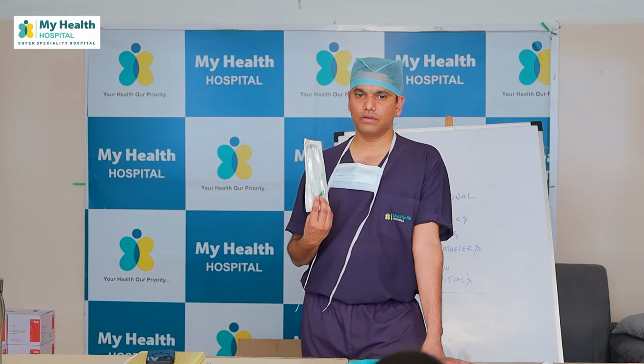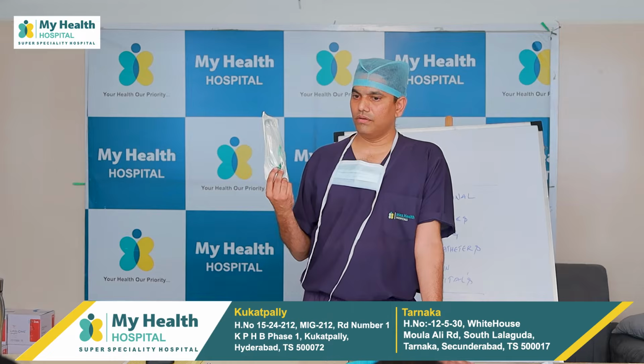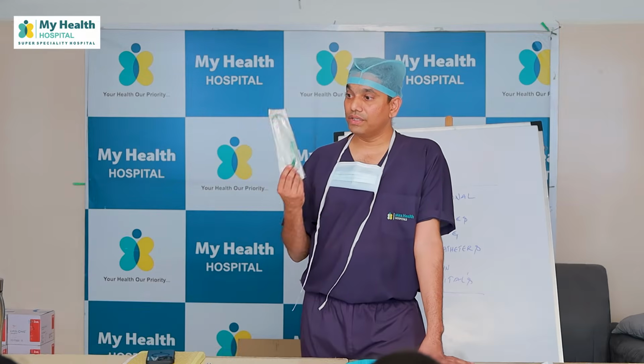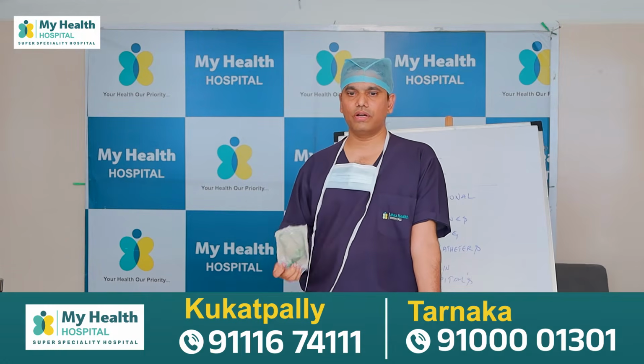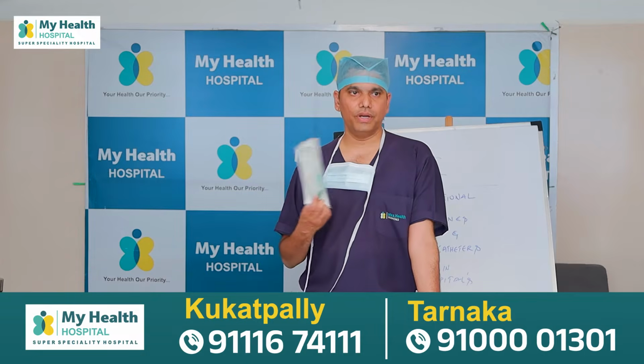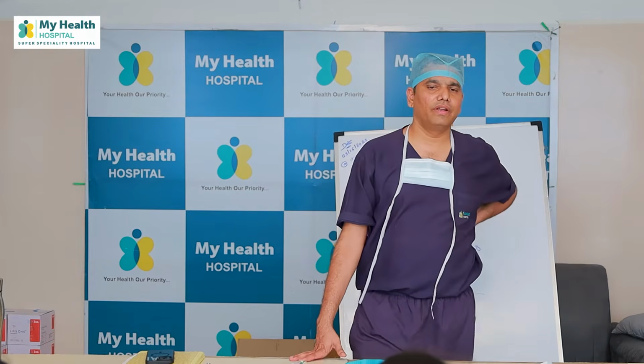Long term patients, why? No, they tend to develop pressure necrosis. To avoid pressure necrosis we use that, which is softer, goes easy, and patient tolerance level will be better with silicone. What is the disadvantage of silicone Ryle's tube? If it is soft, it is technically challenging.